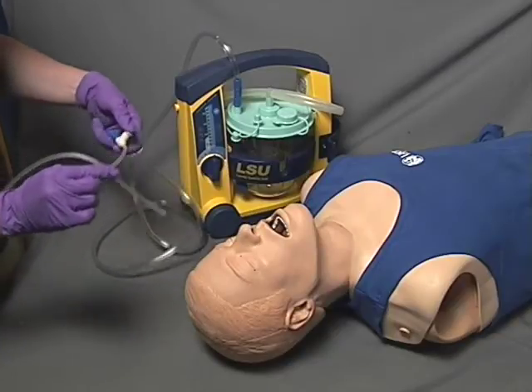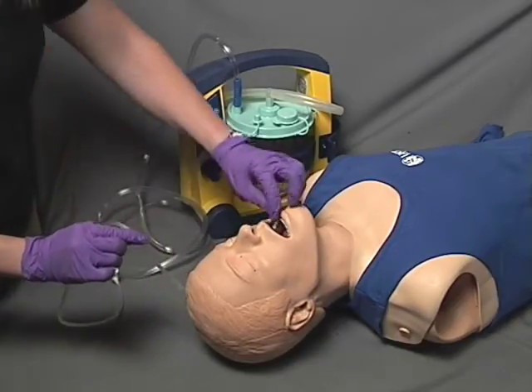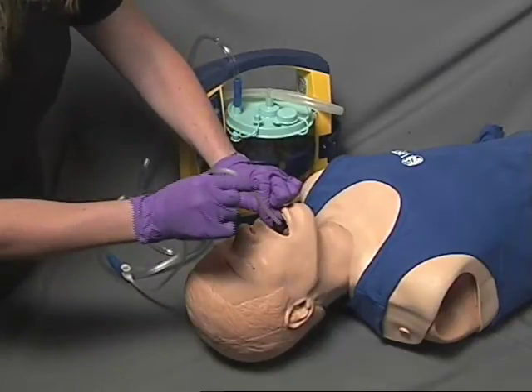Turn the unit on and test the device to ensure suction is present. Open the patient's mouth using a cross-finger technique, a tongue depressor, or other similar device.